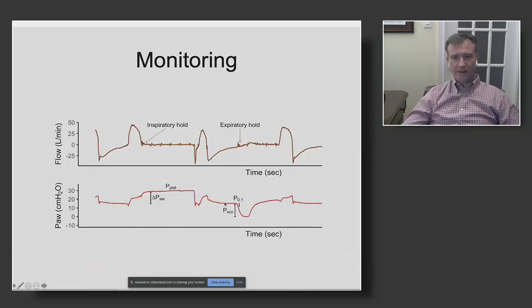Easy methods for detecting vigorous inspiratory efforts are two different pressure measurements. If you maintain an end expiratory hold in a spontaneously breathing patient, you'll see that here there's an expiratory hold, so no flow develops. And all of the patient's effort now becomes apparent because a negative pressure swing develops. We use this measurement, referred to as POCC, to detect large inspiratory efforts.